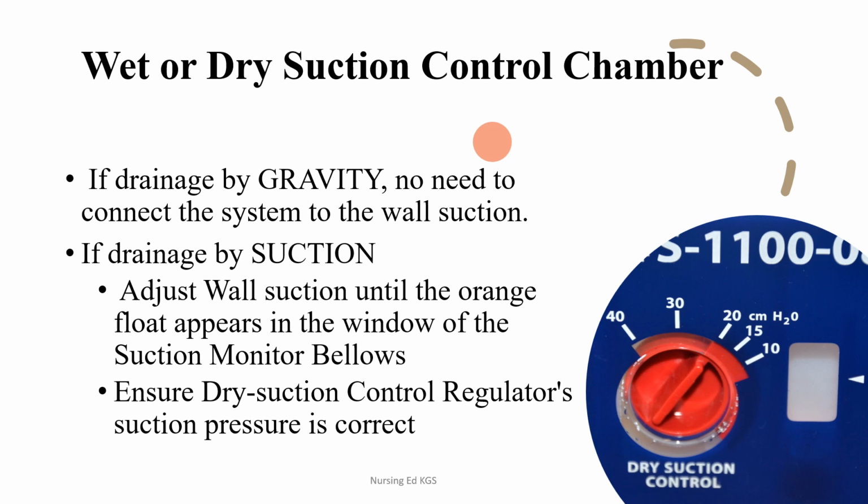Always remember that if there is less water, there's less suction. The amount of suction will vary and it will depend on the patient. It is controlled by the chest drainage system and not the suction source. You will monitor the fluid level to ensure that there is gentle bubbling in the chamber.